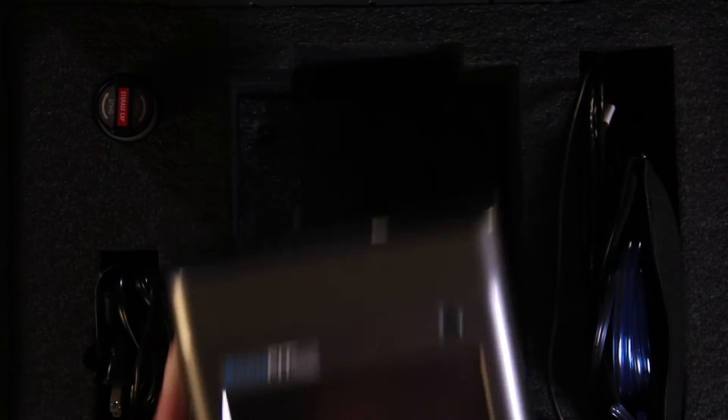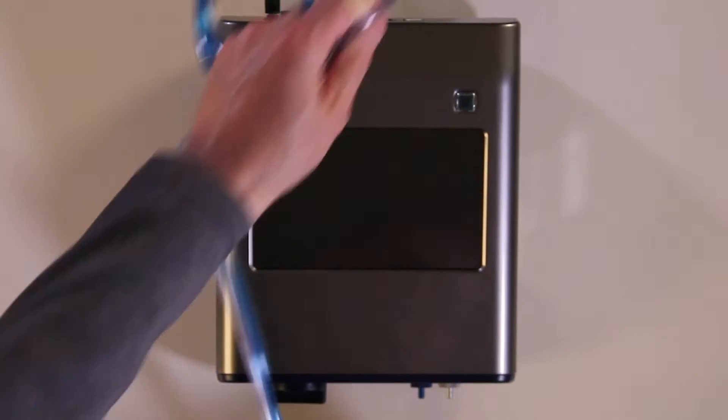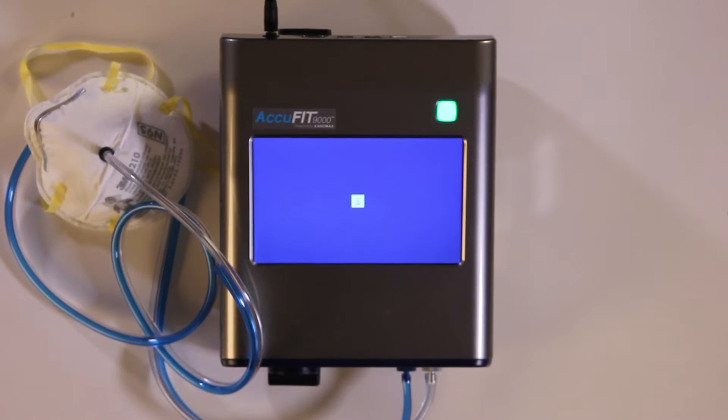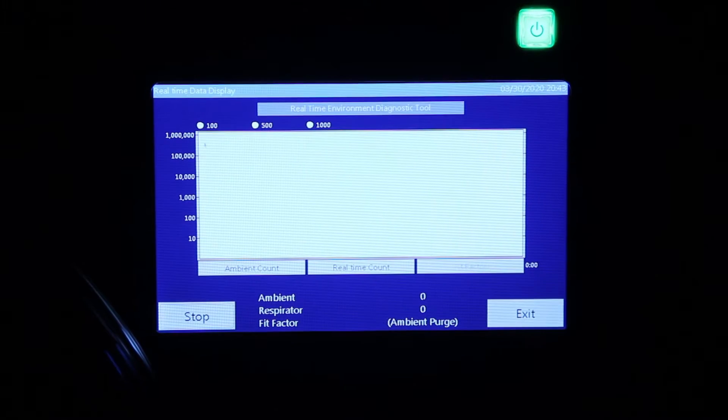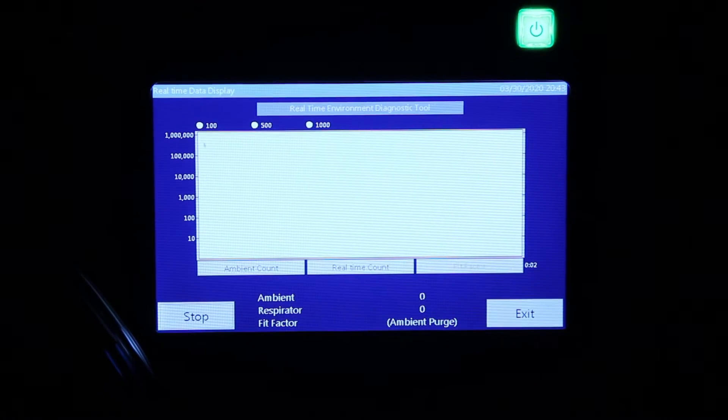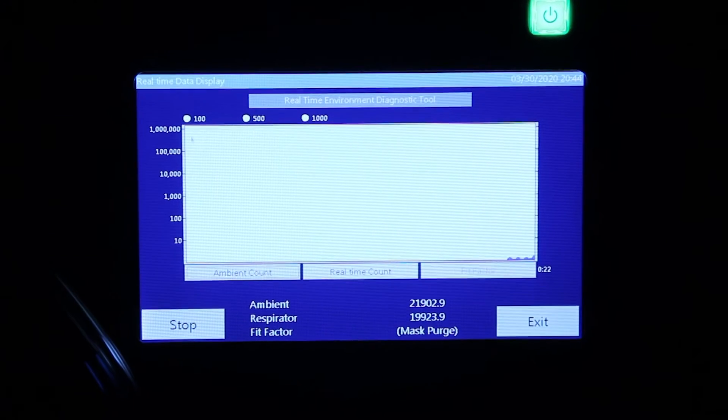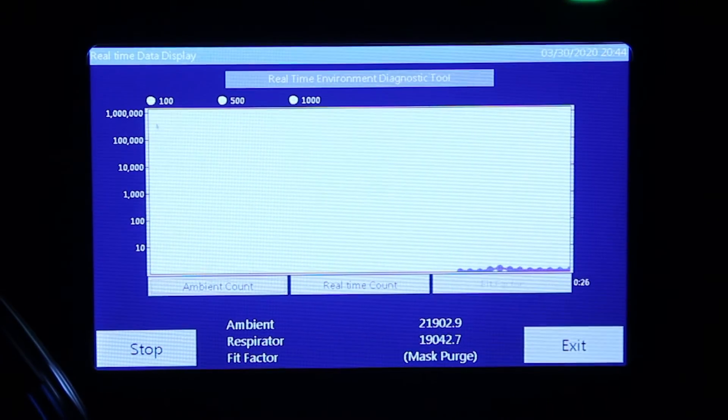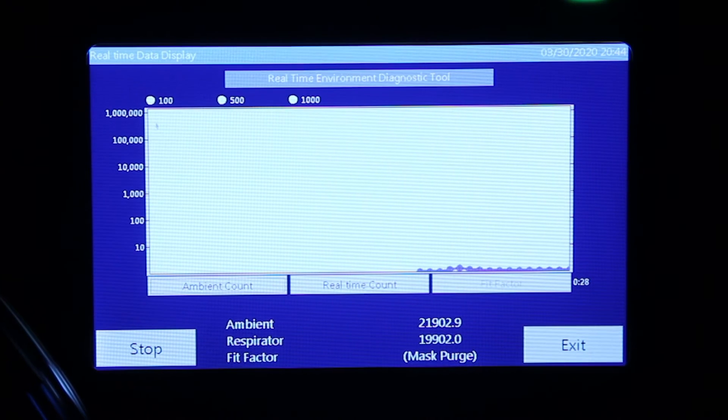Set up the AccuFit 9000 as you normally would to perform a fit test or a validation check. Then touch the Realtime icon. The AccuFit 9000 will provide a real-time count of the particulates in the immediate area and you can quickly determine whether or not you need to employ a particle generator.